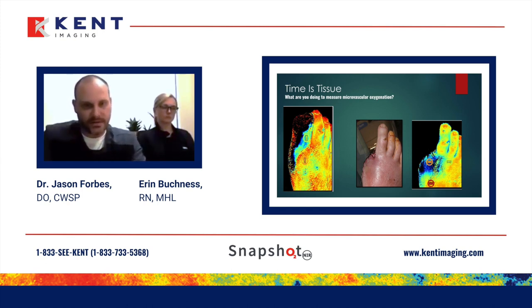Sometimes a podiatrist will just send them over and say, I've done the surgery, go back to you, please get that healed. I'll do a NIRS image right after surgery, and I might get a picture just like this on the right, where you've got really good blood flow except right in that peri-surgical area.